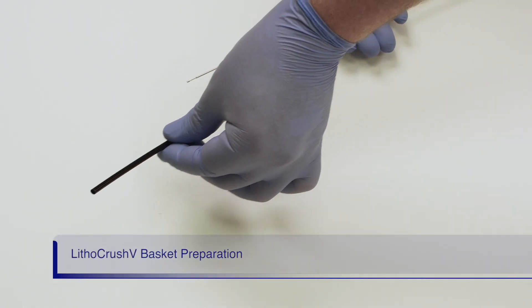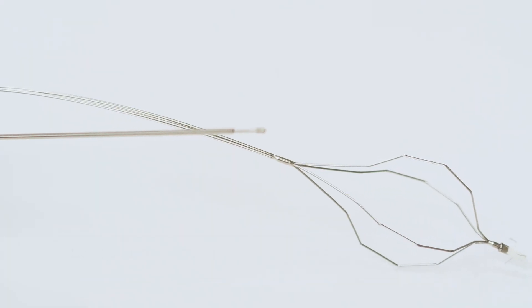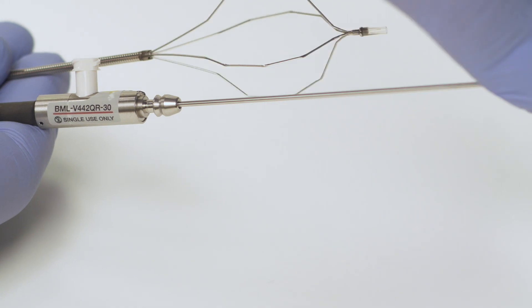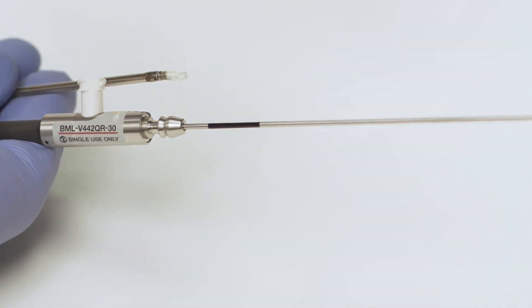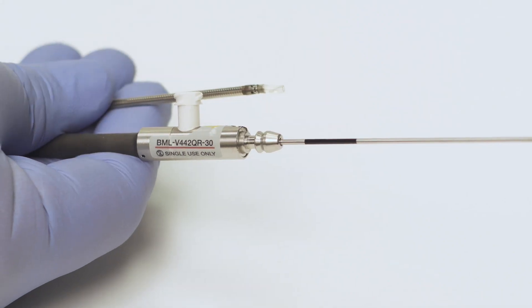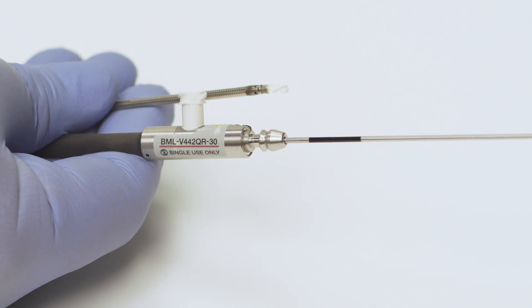First, remove the black protective sleeve from the tip of the basket. Second, withdraw the stem at the proximal end until the basket is fully retracted. When the stem is fully withdrawn, a black mark will be visible on the stem. This indicates the basket is ready to be assembled to the handle.